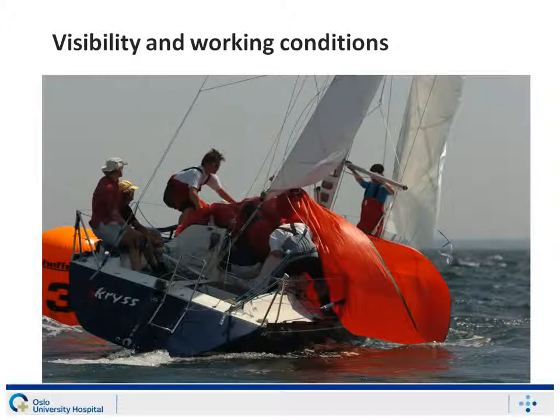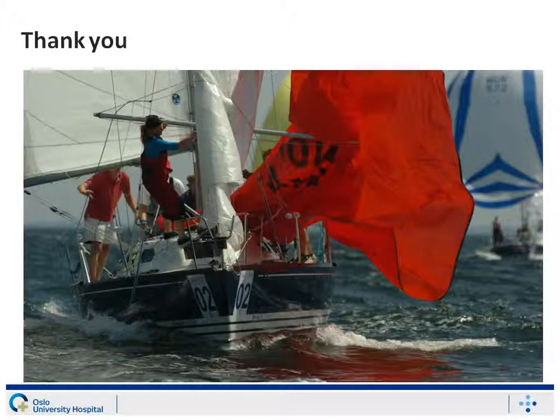Like everything else in the world, the crucial factors for hip arthroscopy are visibility and working conditions. And this guy here has what every arthroscopist fears, a total red out. Everything where he looks is only red. Whereas this guy up here has a complete overview of the situation, can make good choices, and can move on, and can make sure that he wins the race. So that's crucial. Thank you.